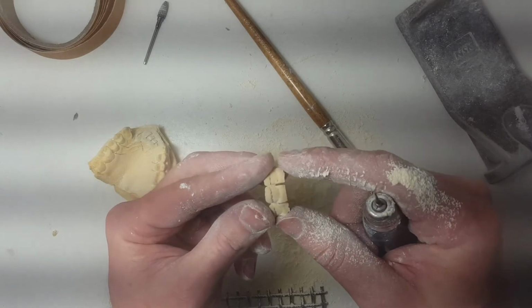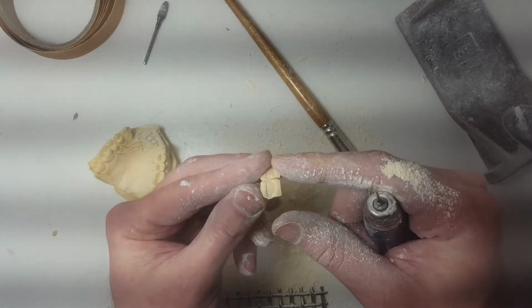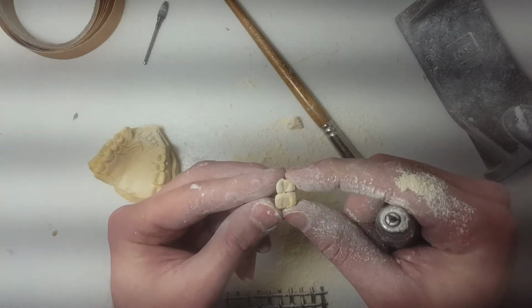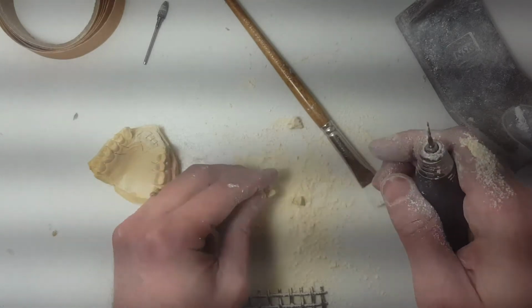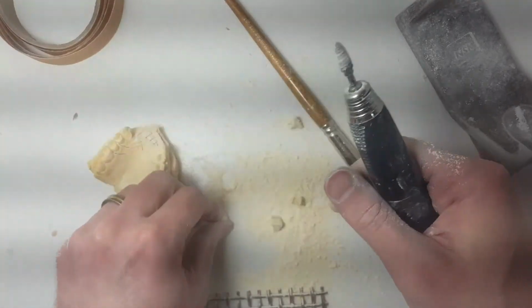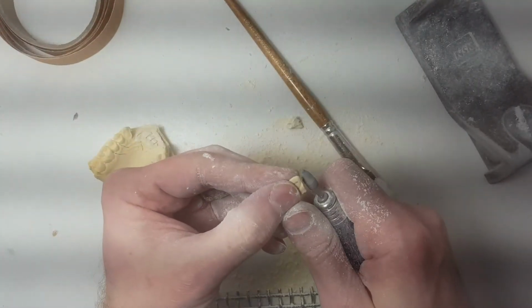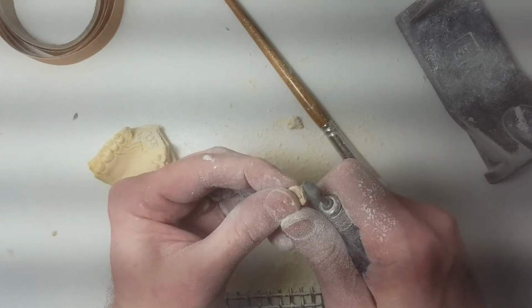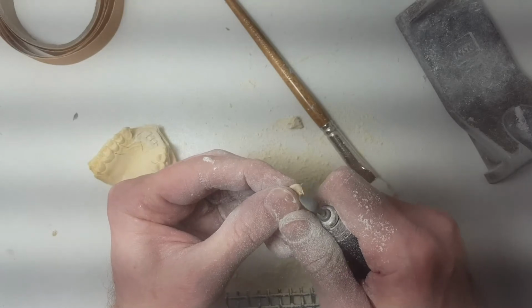So then you just kind of squeeze it. And if you've scored it right, it should just break off. And I'm lucky again. I scored it right. Sometimes when I'm filming these, half the tooth will break off with it. It's kind of risky, but as long as you can score it.